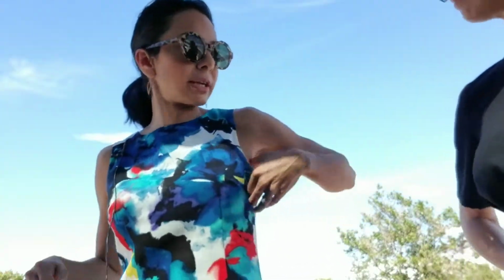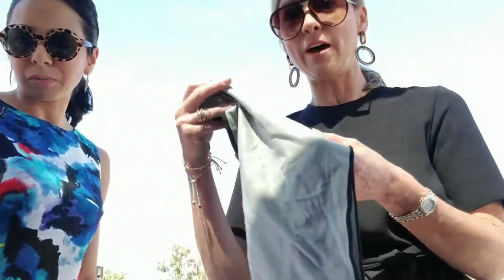But another option is to tuck the pump into your bra. I know Christy likes to tuck it into the side. I've seen women clip it to the middle, or tuck it into the cup. So there's tons of ways that you can wear it with a dress, and it doesn't have to necessarily show.